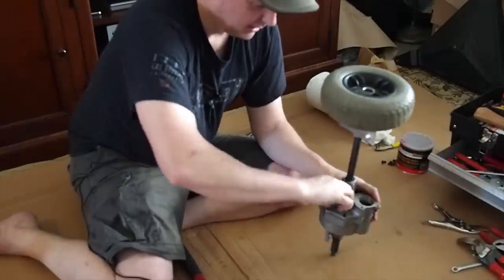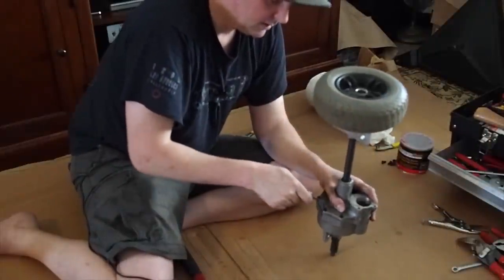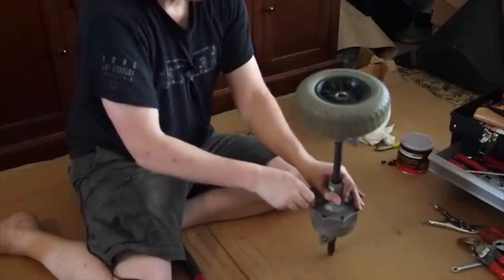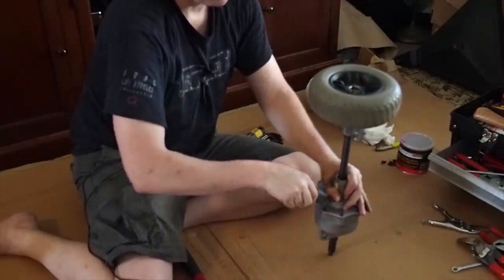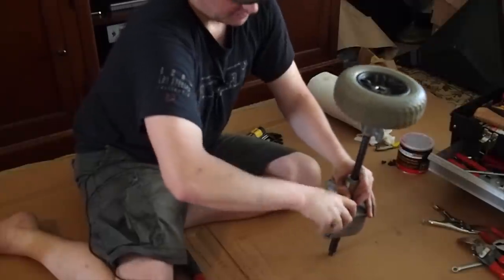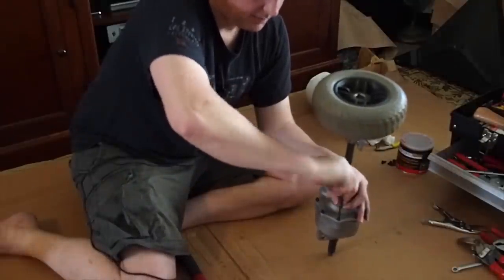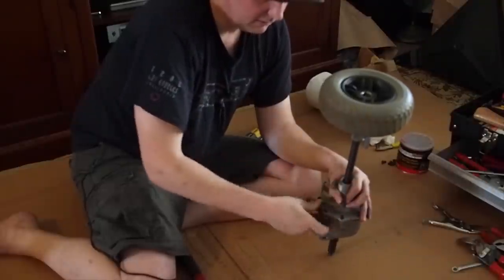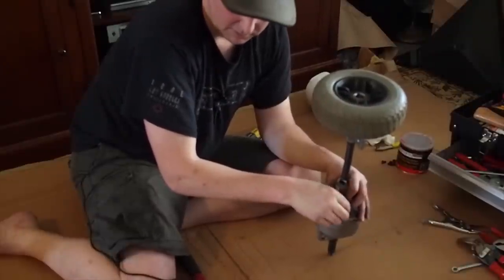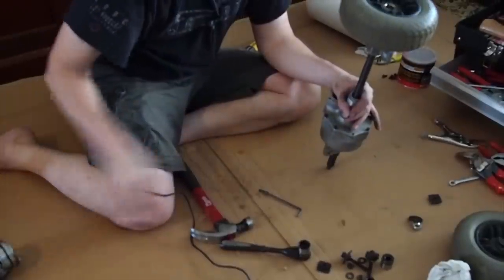Having worked on engines, I tend to, and this is not necessary here, but I tend to do screw patterns, which I don't think is really necessary, but why not? When you're putting on a tire, of course you want to use a bolt pattern. I'd say the same thing about the transaxle here too. Not so much taking it apart, which is what I'm doing now, and I'm just loosening each one before I go the long way because it's just easier to turn. But putting it together, why not use some kind of pattern and just go opposite and make sort of a star pattern with your bolts. I already took off three bolts that were holding on the motor, so I'll just put the others with them.